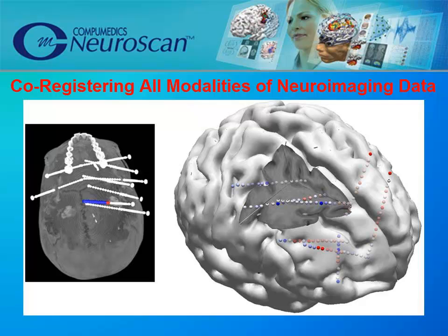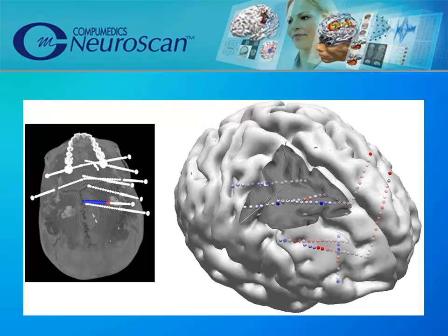CURRY merges these different datasets together, as well as PET, fMRI, SPECT, DTI, and other datasets. For example, depth electrodes from the CT can be displayed with the MRI data. The different colors on the grid electrodes display positive and negative voltages. Of course, the EEG waveforms can be displayed as well.